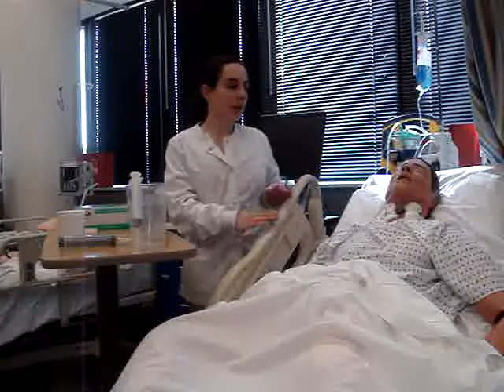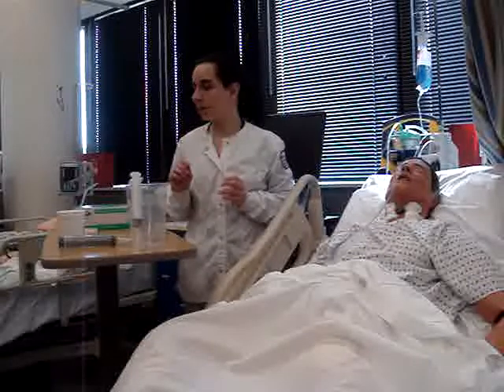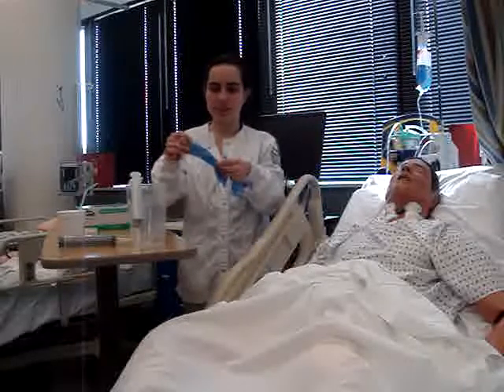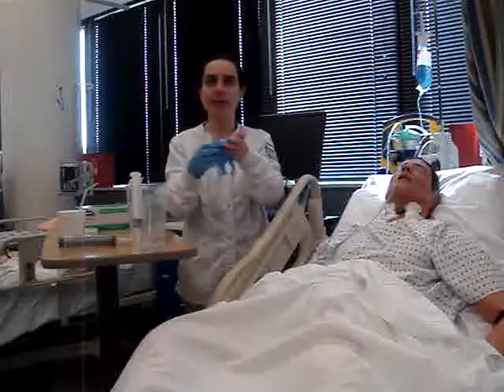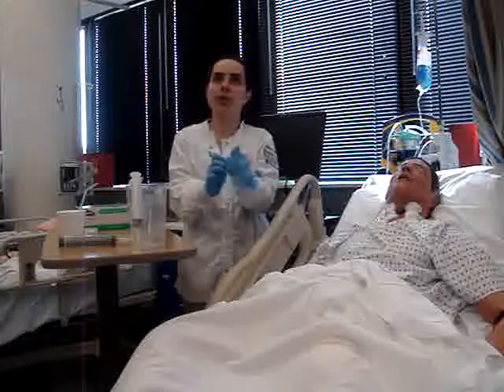I will position the bed in an elevated position with at least 30 degrees, and I will put on gloves and verify the tube placement. I can verify the tube placement by position of marking on the tube. I can measure the length of the exposed tube and compare it to whatever I have in the documentation already.